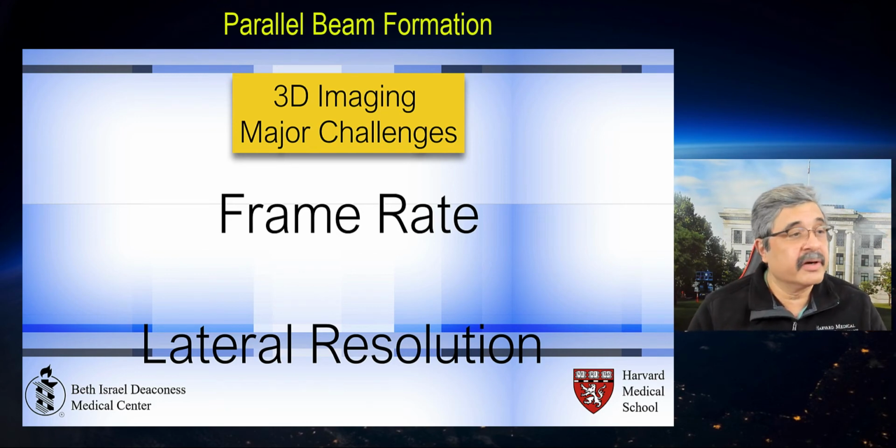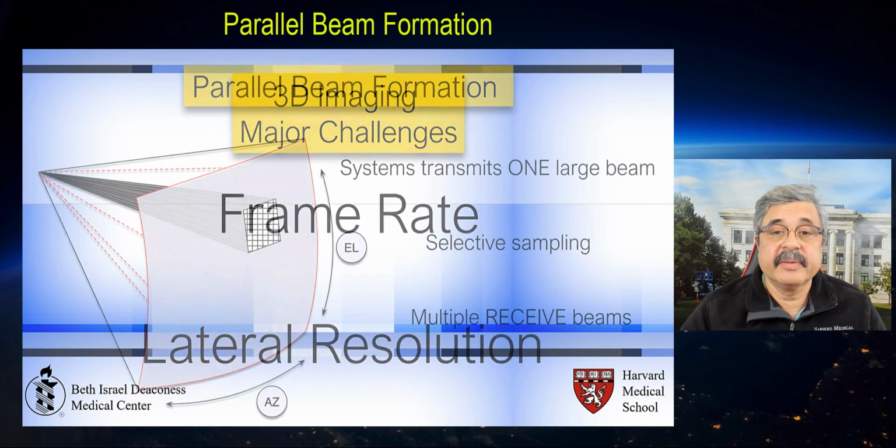There's a significant reduction of your sector size. And therefore, by increasing the sector size in any dimension, you're also compromising on your lateral and elevational resolution. These are the two major challenges in three-dimensional imaging.